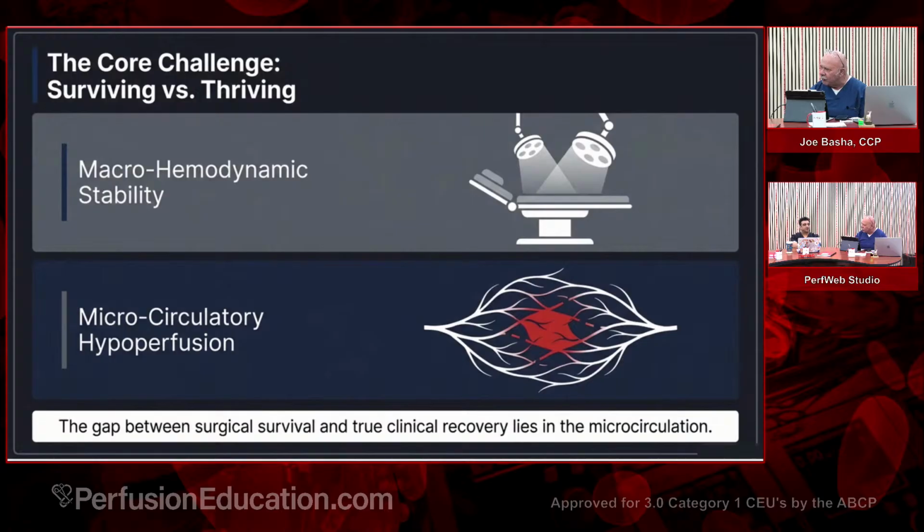I feel there are other indicators, though. Yes, we're not measuring lactate, but we are measuring bicarb and base excess. This is true, if you know how to pay attention to your bicarb and base excess. You know where this gets confusing? Where? This particular patient, the surgeon wanted CVVH throughout the procedure. Oh, okay. That's where it'll get confusing. Now that gets double confusing. Yeah, that's double confusing.